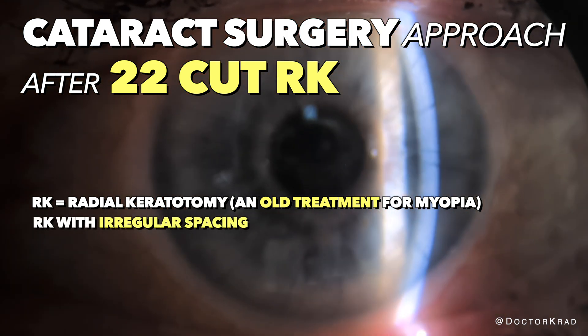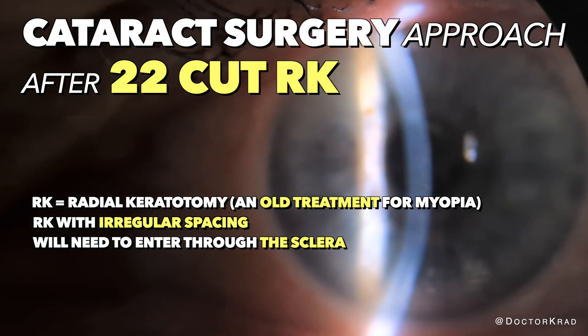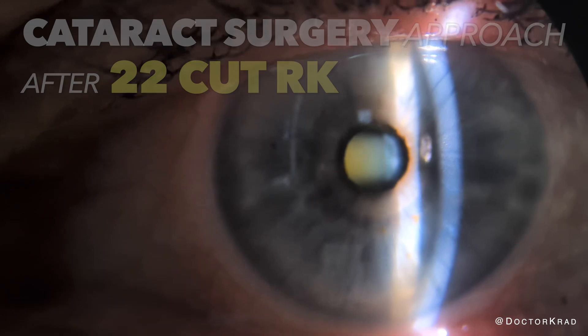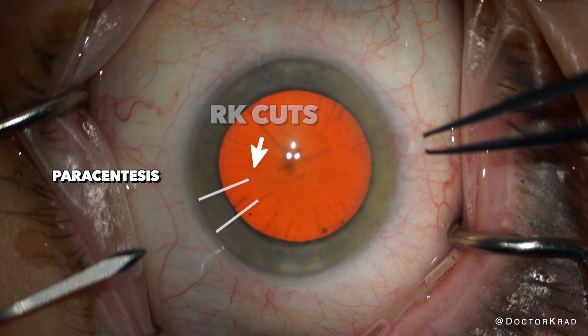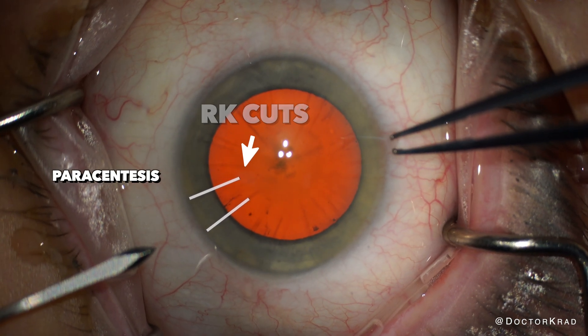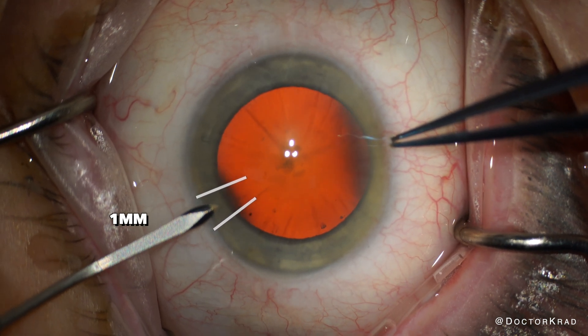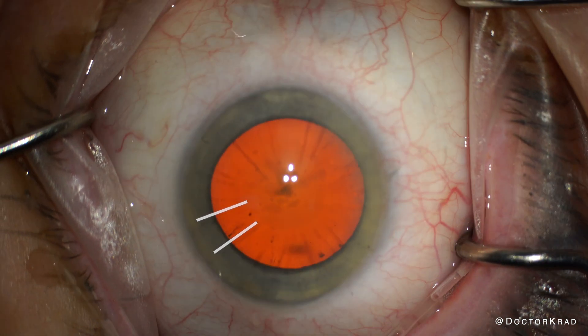I'll show you my approach since there is no space for a main incision in the cornea. She underwent 22-cut RK 30-plus years ago, and the spacing between the cuts are a bit irregular. The 1mm paracentesis incision fits in between two RK cuts, but just barely. But the main incision will definitely not.